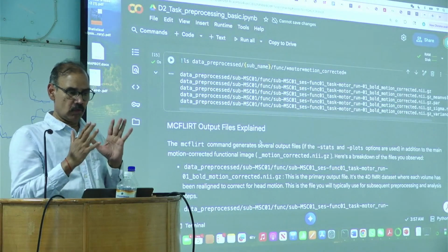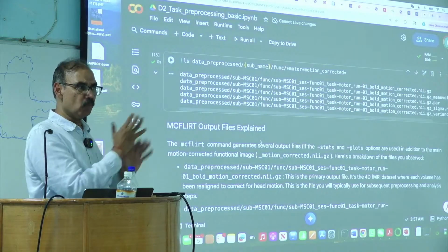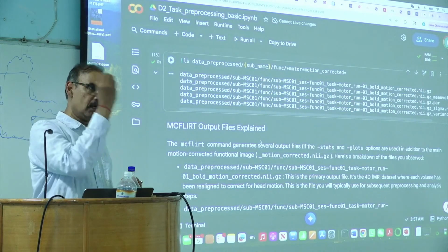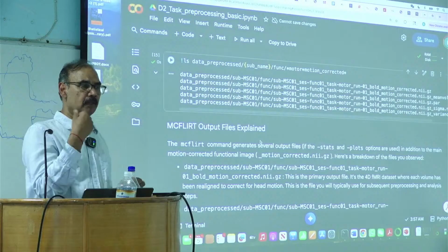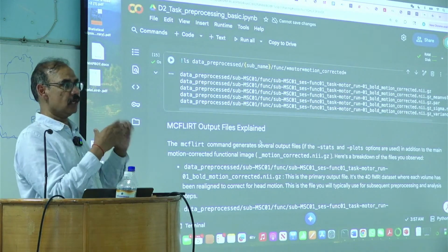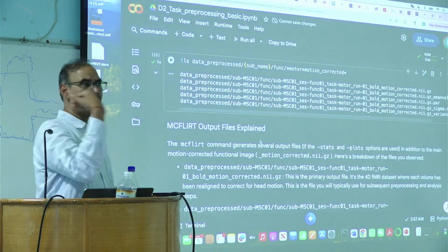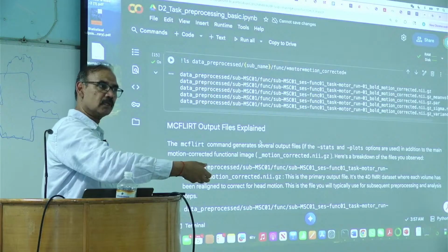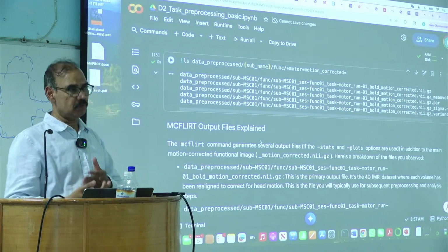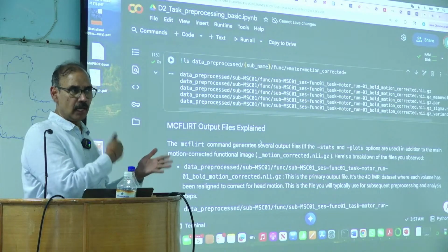And so the only thing where there is a change is the object moving. In DTI, there is a change in intensity, right? So in that case, you're taking a photo as the brightness is changing, and then you have to do motion correction. So it's not as straightforward. It's a little more complicated.